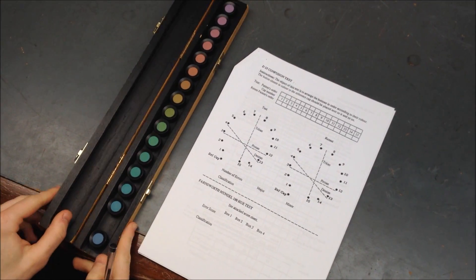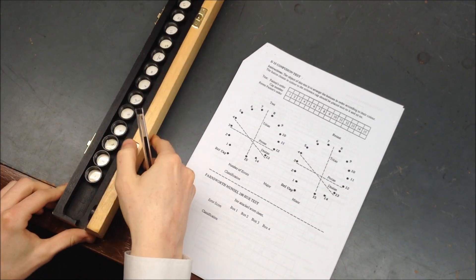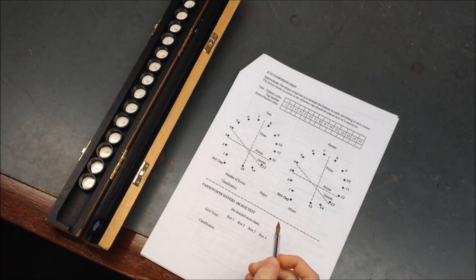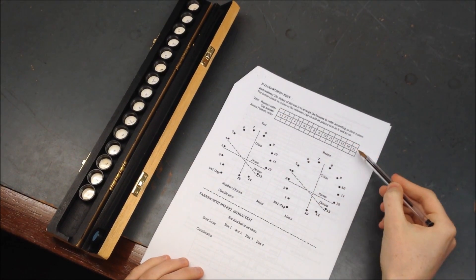So here we have Tom's results here. In order to assess these we'll just flip them over. Now this is the sheet we use to classify each patient. So as you can see here it says cap numbers and it goes from 1 to 15.